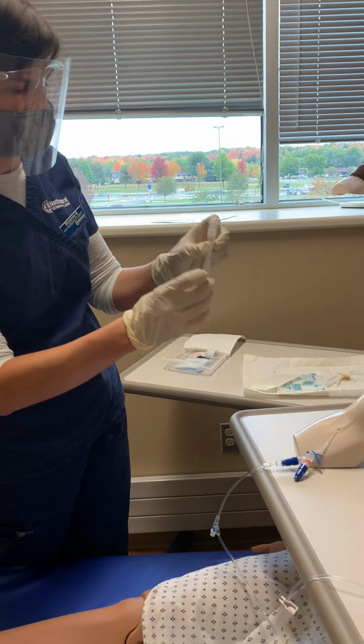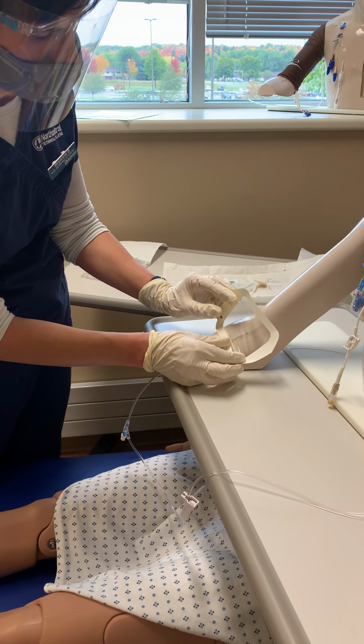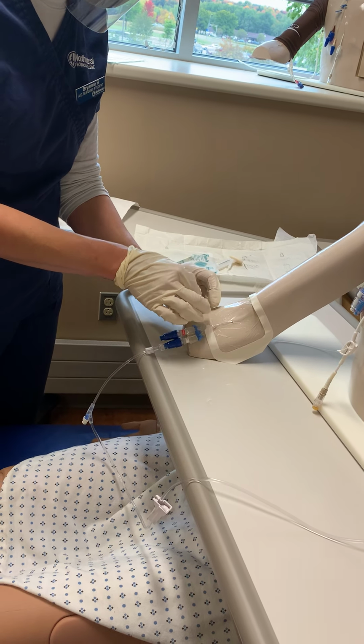I'm going to put this on in such a way that you can still see the site clearly for future assessments. Trying to get it on there as flat as I can, making sure there aren't any bubbles. And again, I had used the no-touch technique to maintain sterility. Pull this off now, making sure that the edges are nice and stuck.